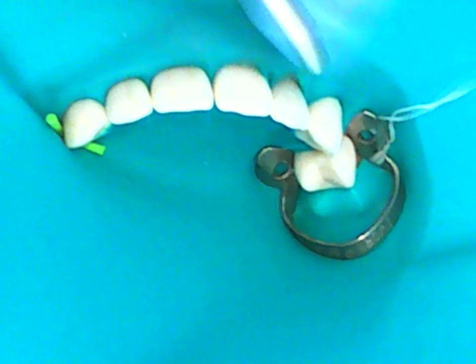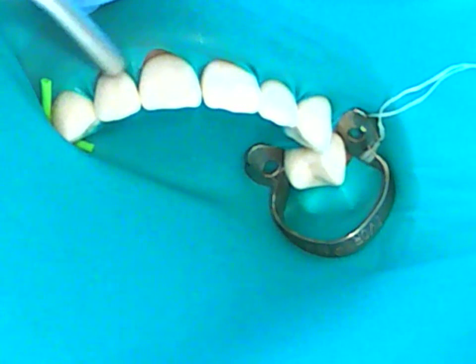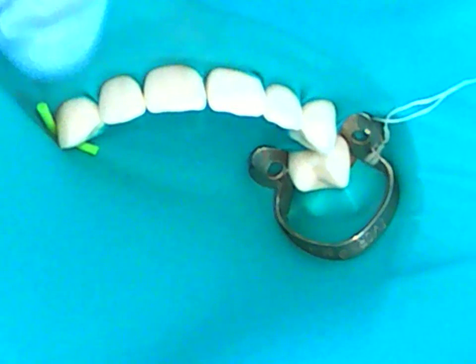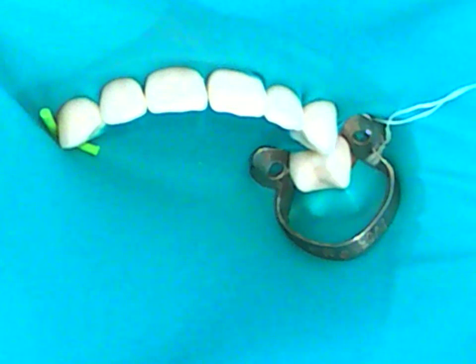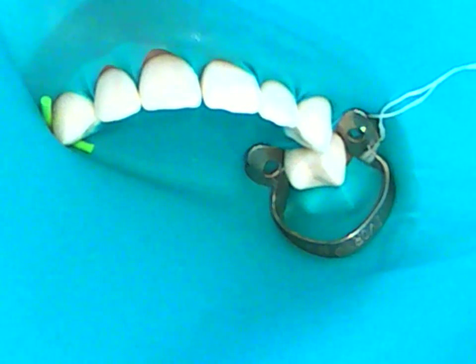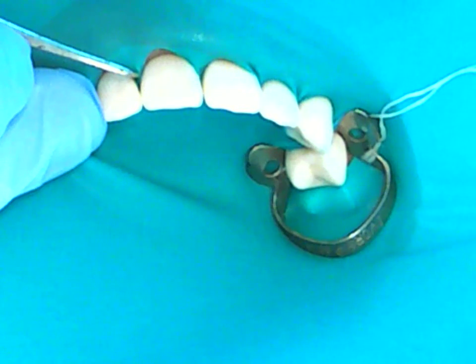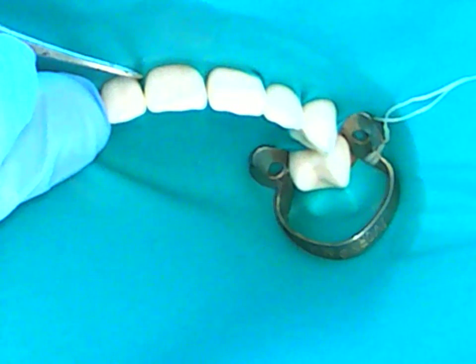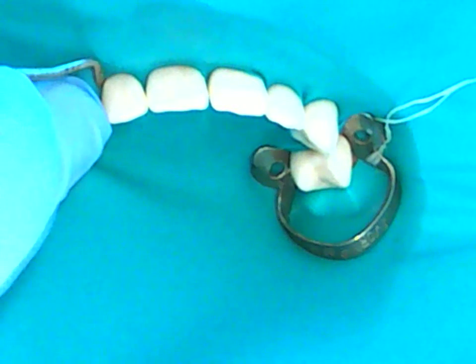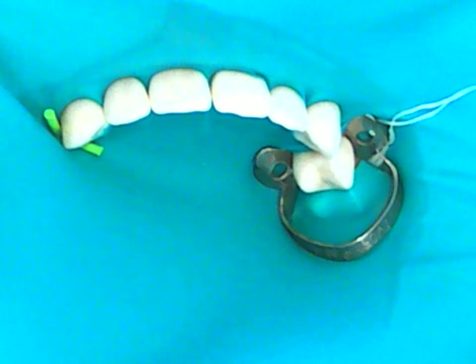So let me try to get you to see. Okay, retract an area, blow basically in the sulcus area, going around your tip, and slowly release your dental dam, and it inverts nicely. The other way of doing it, if that is not successful, is to introduce the flat plastic instrument. The technique is the same for retraction. We would retract it, slip your flat plastic instrument on the mesial or distal aspects, release your dental dam, and roll the flat plastic while you maintain a fulcrum from mesial to distal. That will give you the inversion of your dental dam where you want a rolled under collar, basically.